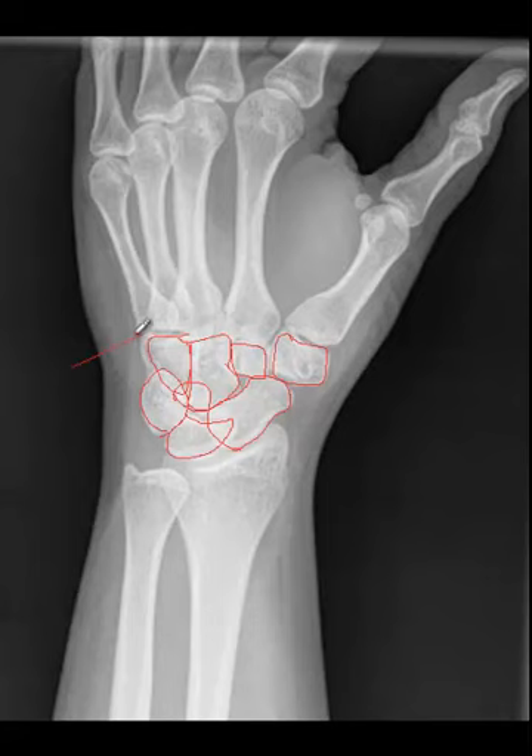Let's test you a little bit. Identify these joints — this is the carpal metacarpal joints. The joint between the distal radius and ulna is the distal radial ulnar joint. This structure is the radial styloid; this one is the ulnar styloid. What lives in this area? The triangular fibrocartilage of the wrist. This is the base of the second metacarpal. This is the head of the third metacarpal. And this joint is the metacarpal phalangeal joint of the fifth digit.